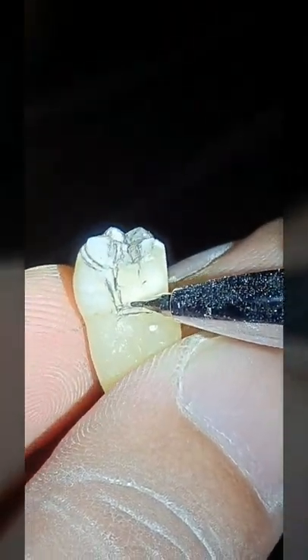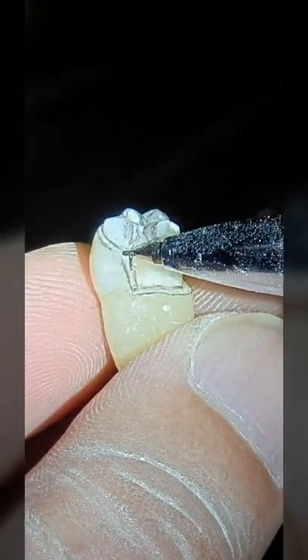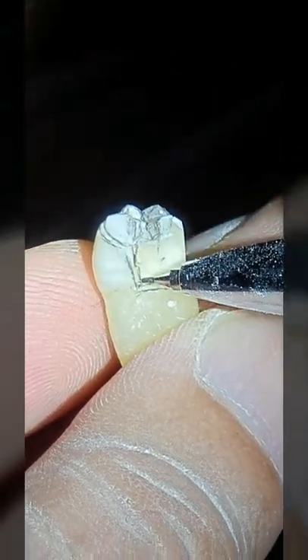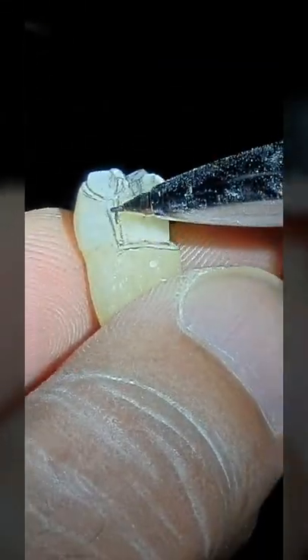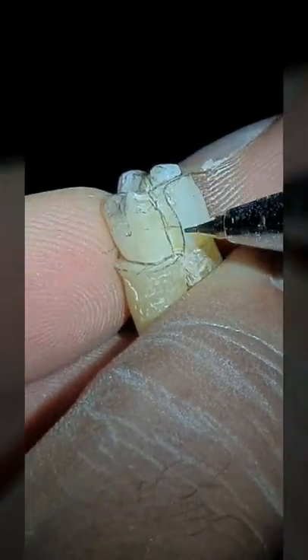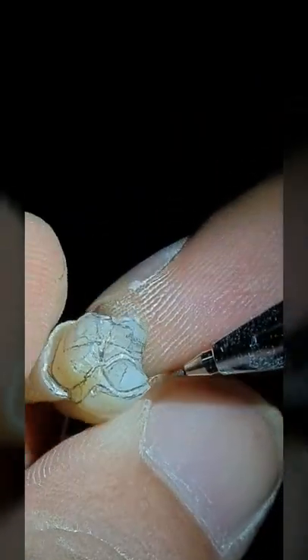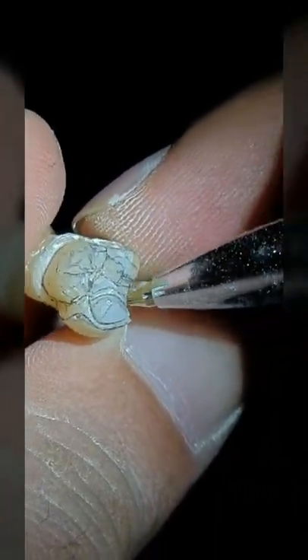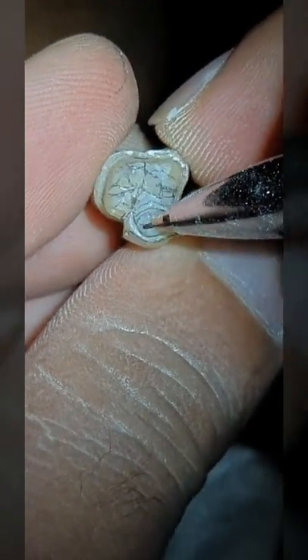And on the distal when you come up, on the mesial when you come up and you take the groove all the way up, now that is going to be divergent from the rest of the prep, so they should not be convergent. This part has to be divergent from the lingual wall. Here also, this has to be divergent from the distal wall, but in line when you look at it occlusally from this groove. Both of these have to be convergent when they come up from the occlusion.